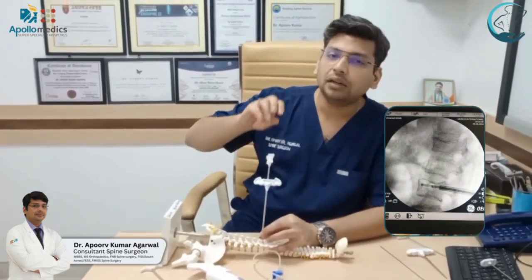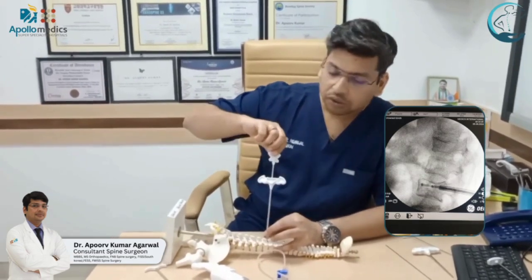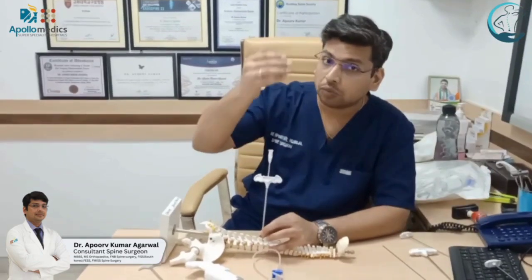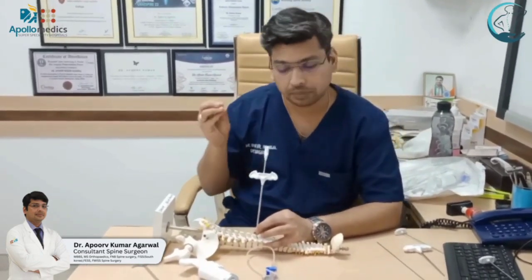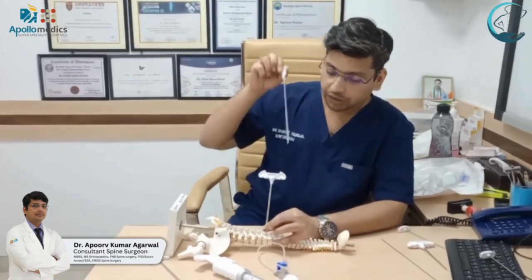We drill the bone to make a clear path for our balloons, which is the next step in this procedure. We drill theoretically to about 3 mm just posterior to the anterior vertebral body, and this is done under C-arm guidance. We drill that part of the vertebral body and then remove the drill.